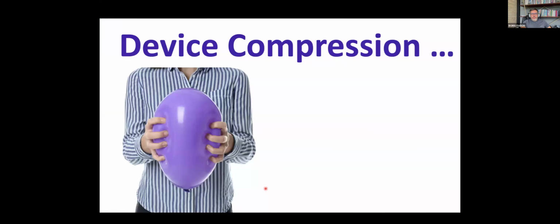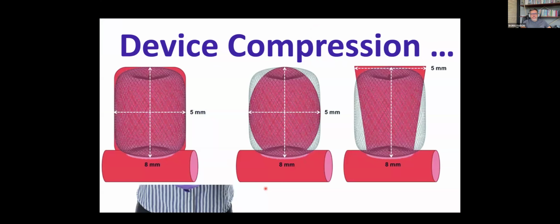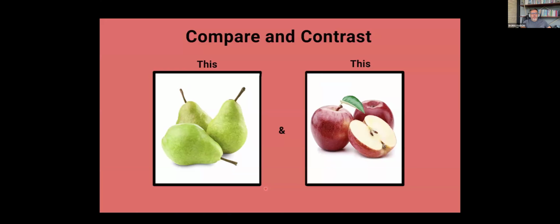Similar to other intrasaccular technology, the device compression is essential, probably less than the web. The web demands or requires greater than 1 point if you really want to get a great long-term outcome. But with this technology, we have evidence that only 0.5 millimeters of oversize would be enough.